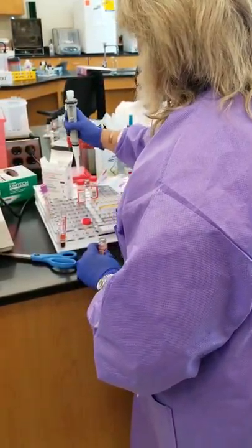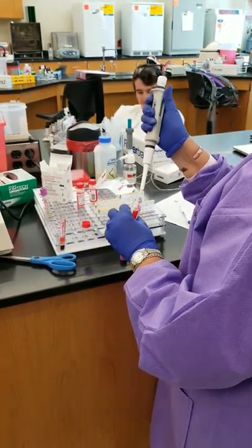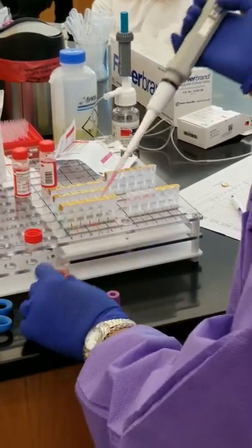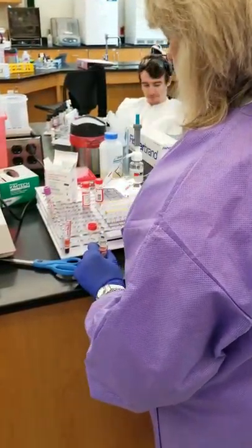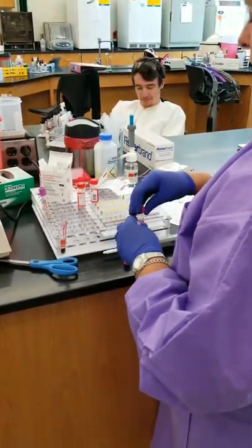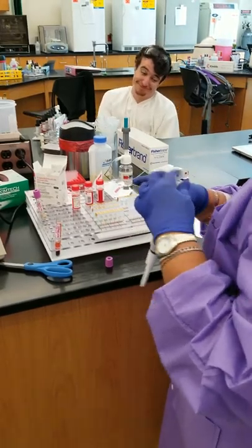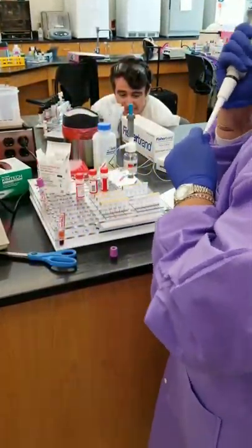So if I were doing multiple patients, I could put three here and three there and then wait for my plasma, where it needed to go. Okay, so I have 50 microliters of my cells. This pipetter doesn't get used very often, so it's very, very tight. Whereas the ones at the hospital are well worn and walk around a lot, and sometimes they drip and do all kinds of other things.